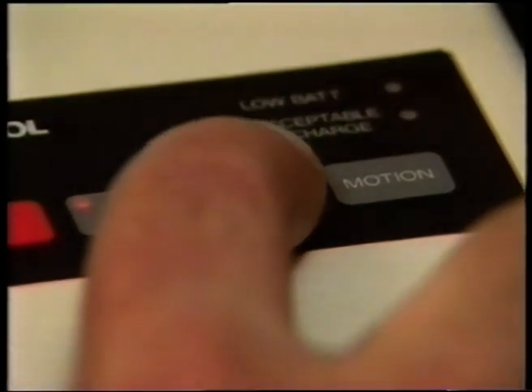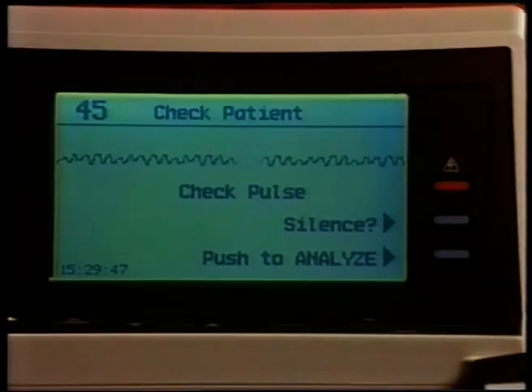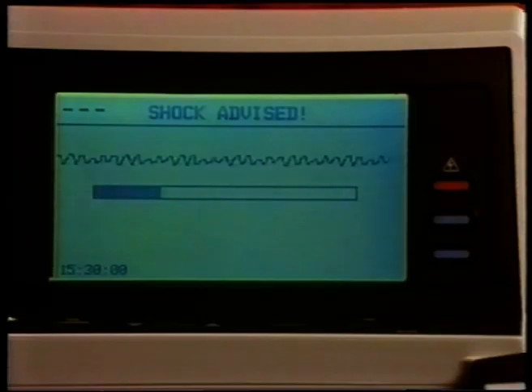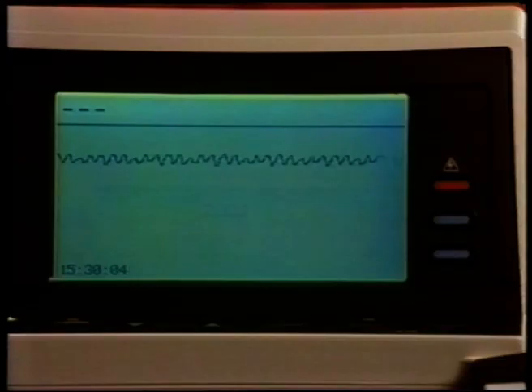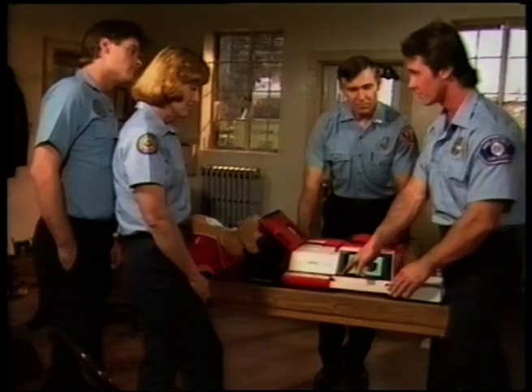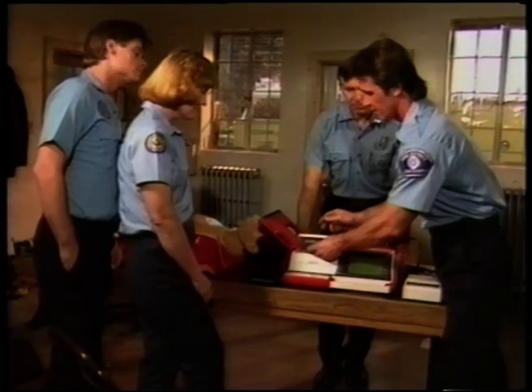Now, place the simulator in ventricular fibrillation by pressing the VF button. Push the Analyze button and wait until the unit is fully charged to 200 joules. Confirm that the low battery or service fault message or symbols are not displayed and push the shock button. Observe on the simulator the acceptable discharge indicator flashing. Turn the unit off. That concludes a basic testing of the LIFEPAK 300.